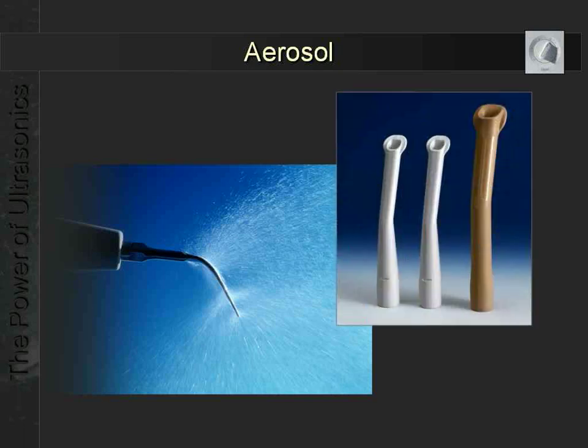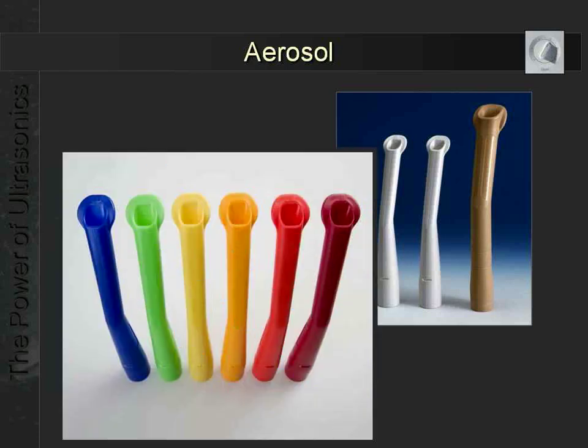So this is an evacuator. I don't know whether you're familiar with it. It's probably old. It's the first Dürr evacuator, but these are called the bambinos, the little children from this one. And the opening is quite okay. It is perfect, so it doesn't suck away the mist which is there, and it is enough to clear the oral cavity. And then there's these extensions which help you to retract the teeth, the cheek and the tongue. And the nice thing, recently they've come in various colors, which brightens up your day when you start to work every morning.